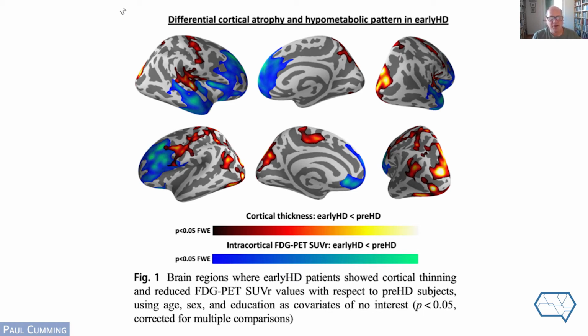And here they compared, on one hand, MR-based cortical thickness measurements, I think these are called zebra images, where they have in effect projected a shaved brain that has been trimmed off so you can see the deep sulci and the underlying white matter revealed in the same surface rendering of the brain. It's a common problem in all brain imaging, how to represent the complex 3D surface using only the 2 dimensions of the printed page or the computer screen.